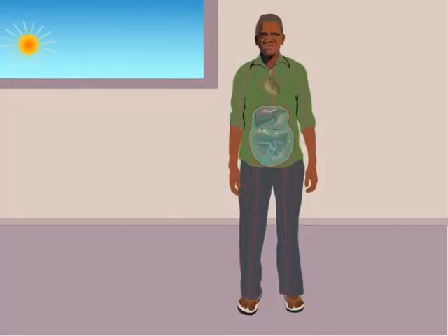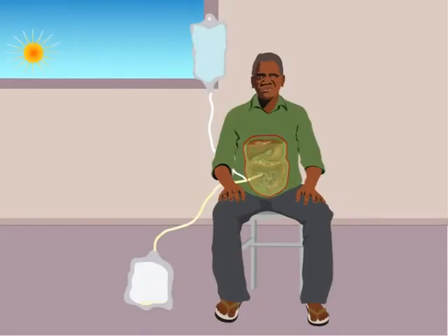This cleaning water stays in your peritoneum for some time, maybe about 4 hours. While it is in there, the rubbish in your blood can move from your blood into the water. After a few hours, you start again.